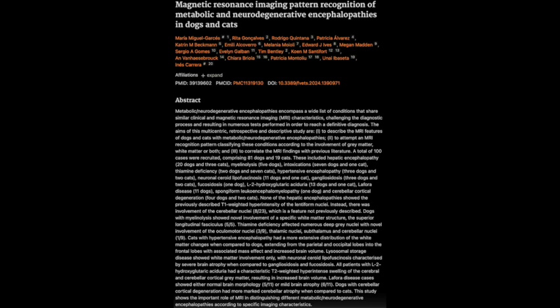Okay, so the superior longitudinal fasciculus. What is that? It's this big white matter tract that connects different parts of the cerebral cortex. So like a pathway. Yeah, like a superhighway of information flow in the brain. Okay, so if that's damaged, then communication is messed up. It's messed up, yeah. And we've never really seen that before in dogs with myelinolysis.